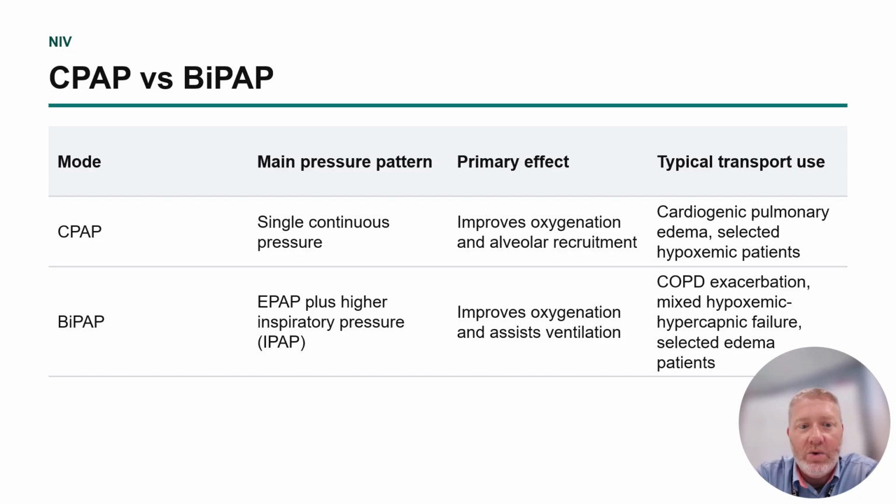We've got your EPAP, CPAP, PEEP as the bottom number, but the top number is the pressure above your PEEP, that when a breath is delivered or triggered by a patient, it'll go up to a top pressure or a peak inspiratory pressure, and that is the top pressure setting on a BiPAP. So IPAP over EPAP.